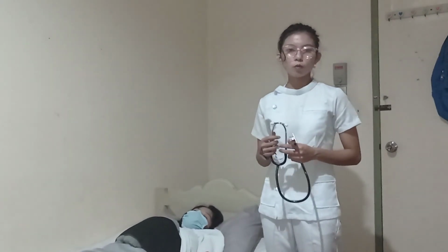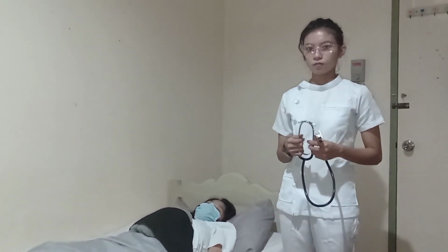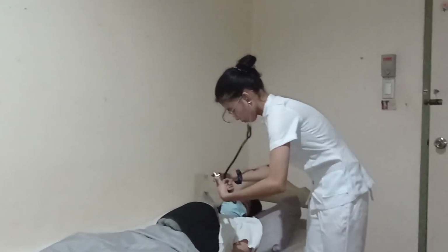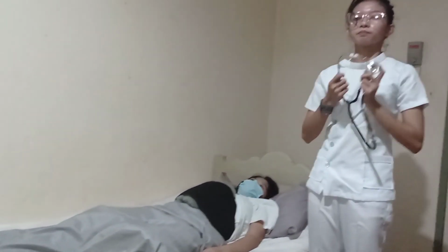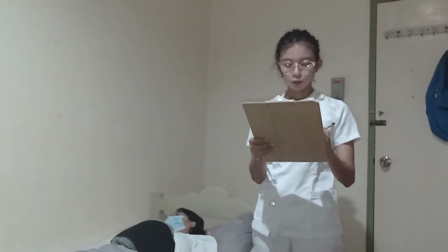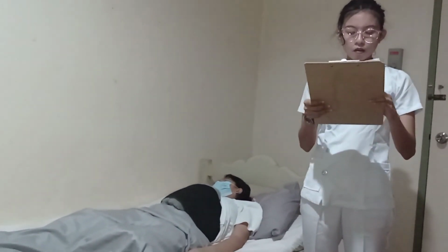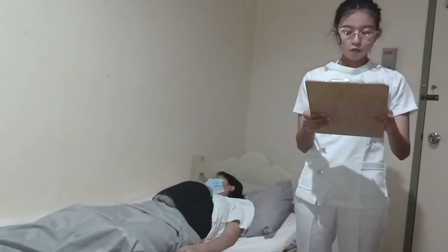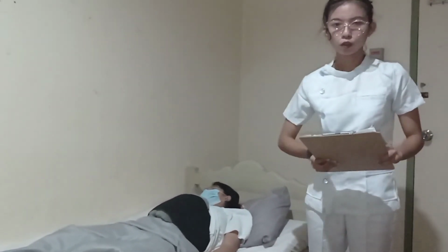Using the stethoscope, we auscultate the fetal heart tone of the fetus. Rate of the fetal heart tone. Next is to make no unnecessary exposure of the client's body and return her to position.